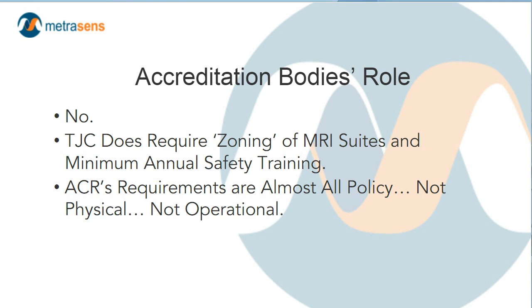In terms of physical environment requirements from the ACR, no, not really. And in terms of thou shalt do it this way, again, no, not really. They do require, as I say, policy and documentation. Those policies just don't have to follow best practices.